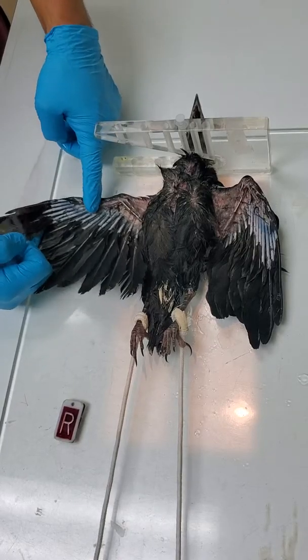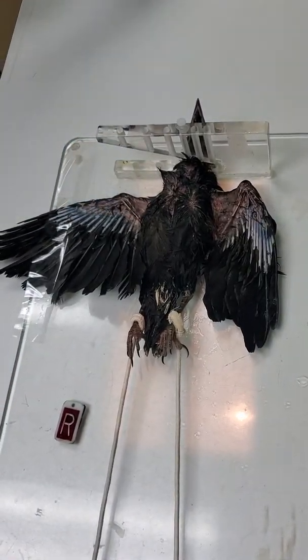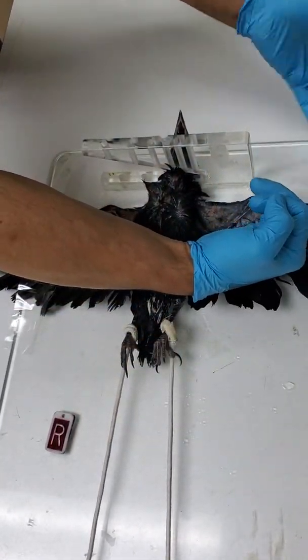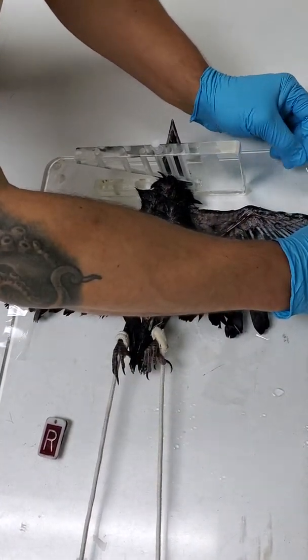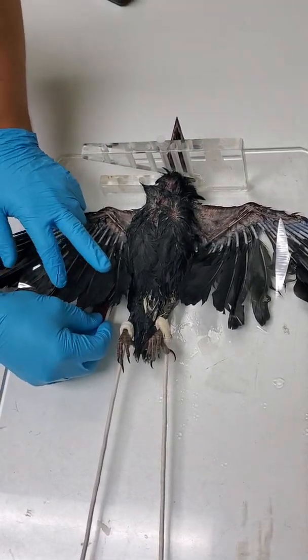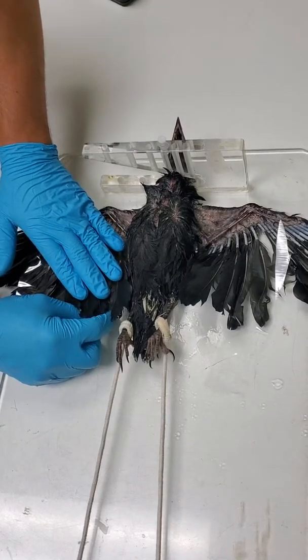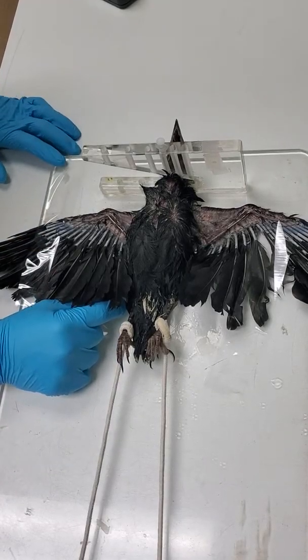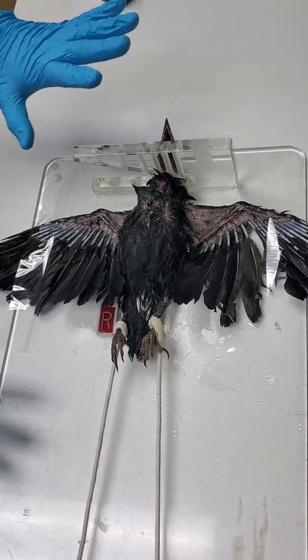Hopefully the bird would be sedated or under anesthesia, just like that. I'd get the wings to match as best as possible. I get my marker into place — since there are feathers here, I can still put the marker underneath because the feathers won't really be affected by having the marker there. I could do it like that, or if we're taking a lower view of the feet I could move the marker, but I would probably put the marker there for an x-ray. So that would be my VD view.